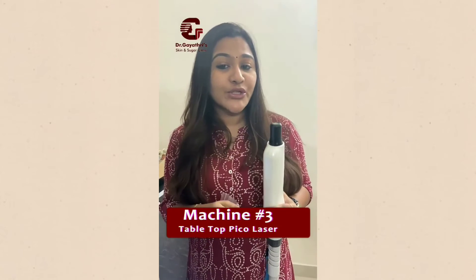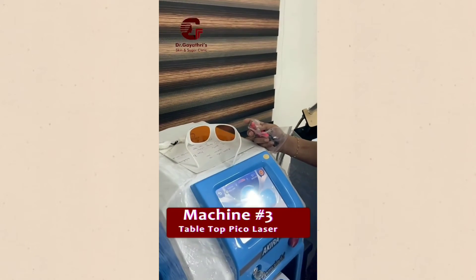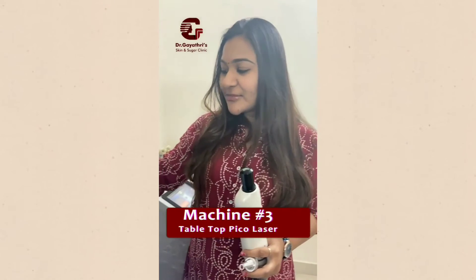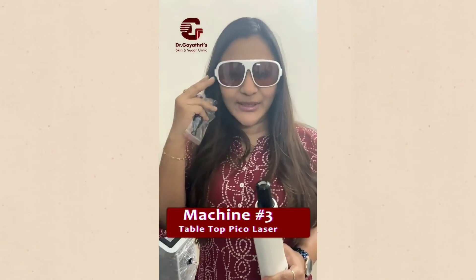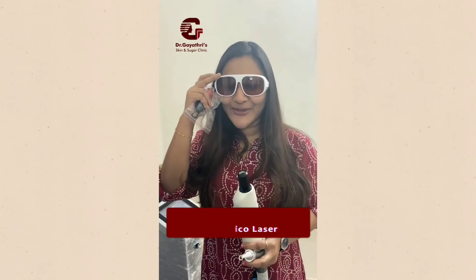We can accordingly remove that. So this is what I wanted to tell you about this machine. Primarily, this is my go-to for pigmentation. And this machine specifically comes with these particular glasses which protect you from the rays of the laser — so this is just an add-on for the eye.